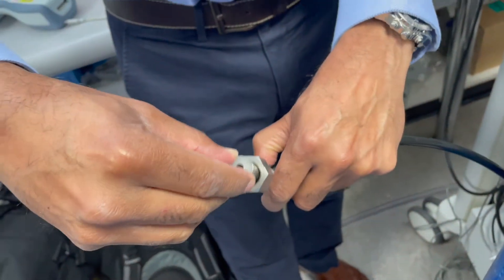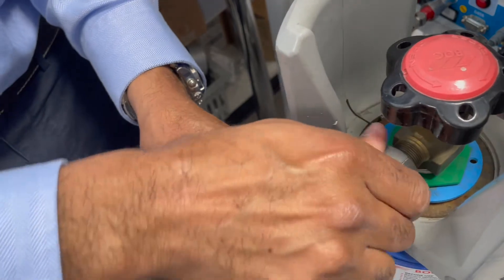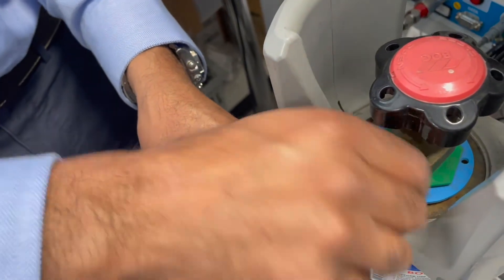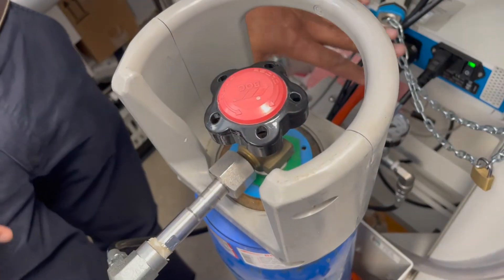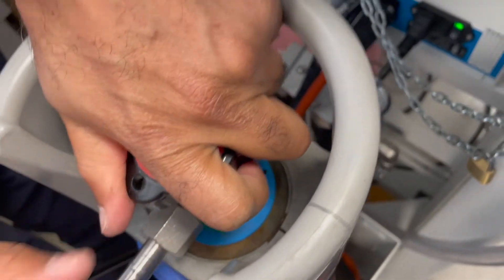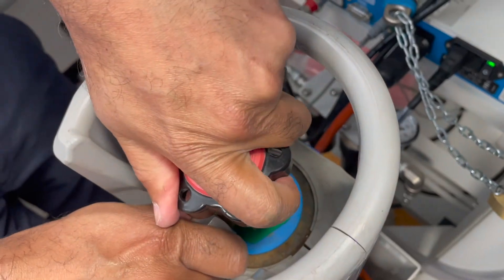When you are threading this, try not to cross thread it. I'm going to try hand tightening this today just to see if it works. Just to check the pressure again I'm going to open it. Let's listen for leaks because I'm hand tightened.